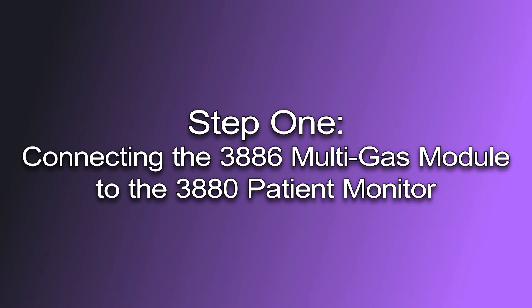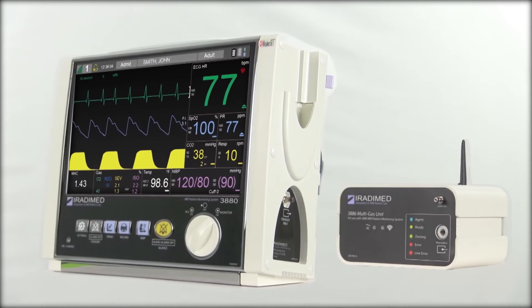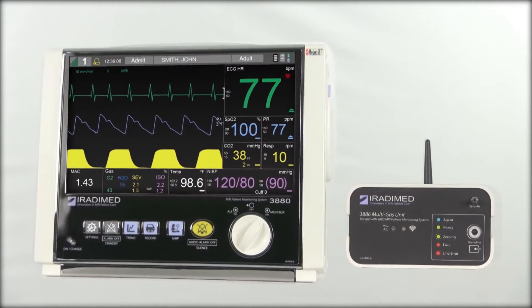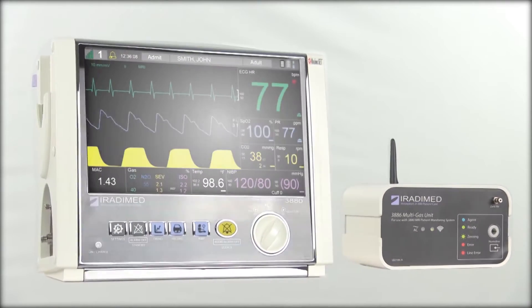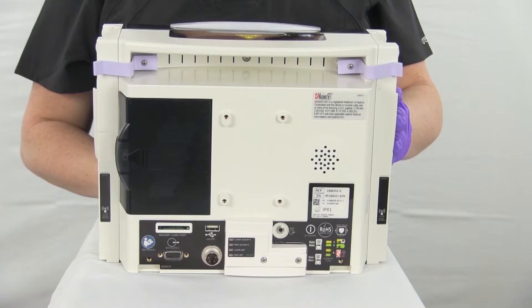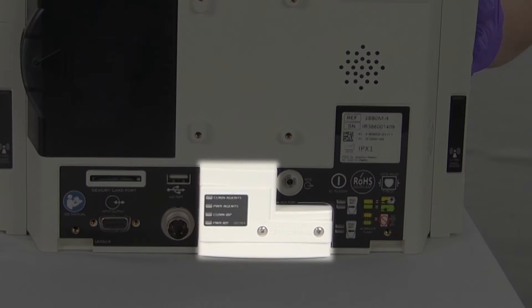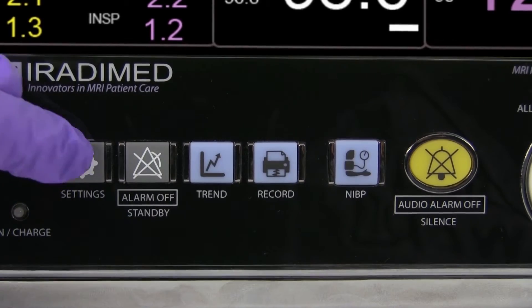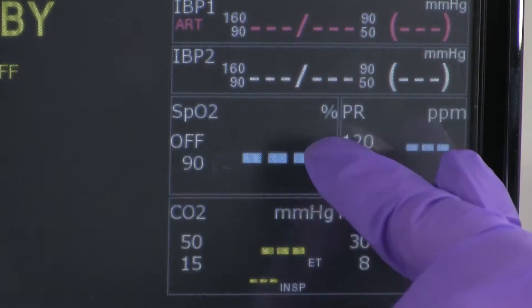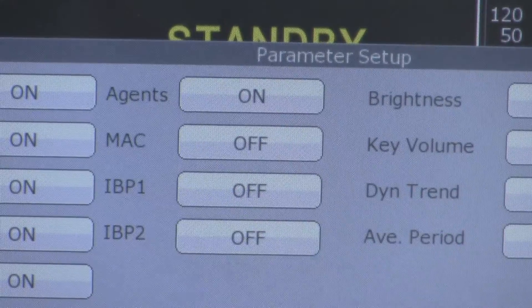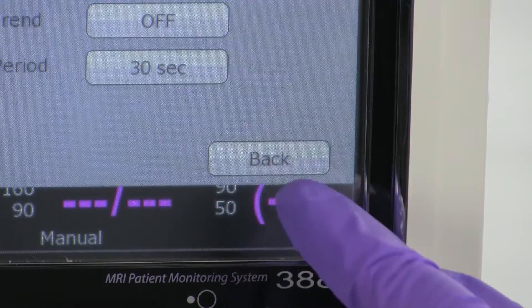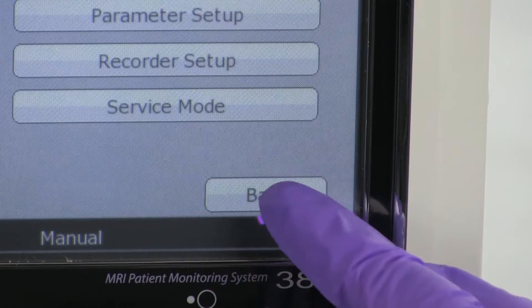Step 1: Connecting the 3886 multi-gas module to the 3880 patient monitor. Before the user can properly monitor patient respiration, anesthetic agents, and MAC readings with the 3886 multi-gas module, the user must first ensure the 1887 accessory antenna is connected on the reverse side of the 3880 monitor. The user will press the settings button, press the parameter setup button, and ensure agents and MAC are turned on. The user will then press the back button twice to return to the monitor screen.